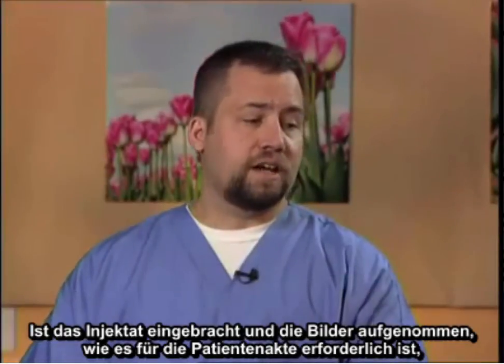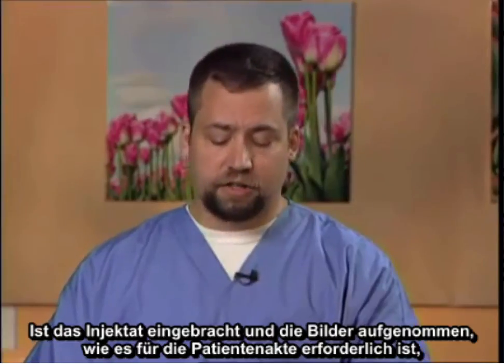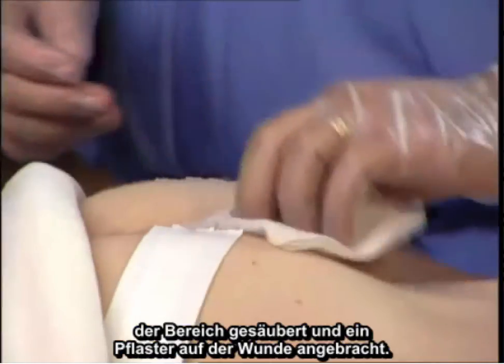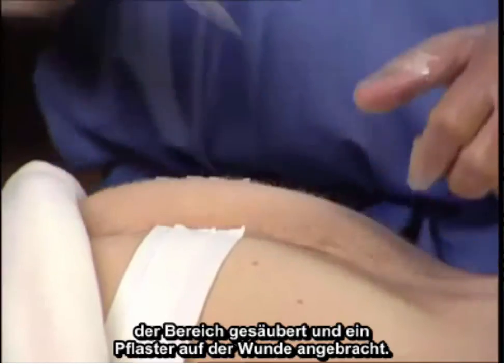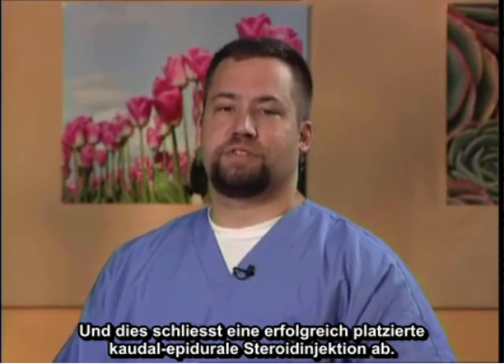Once the injectate is done and the image is recorded as necessary for the medical record, the probe is removed, the needles are removed, the area is cleaned, and then place a Band-Aid over the wound. And thus, this concludes a successfully placed caudal epidural steroid injection.